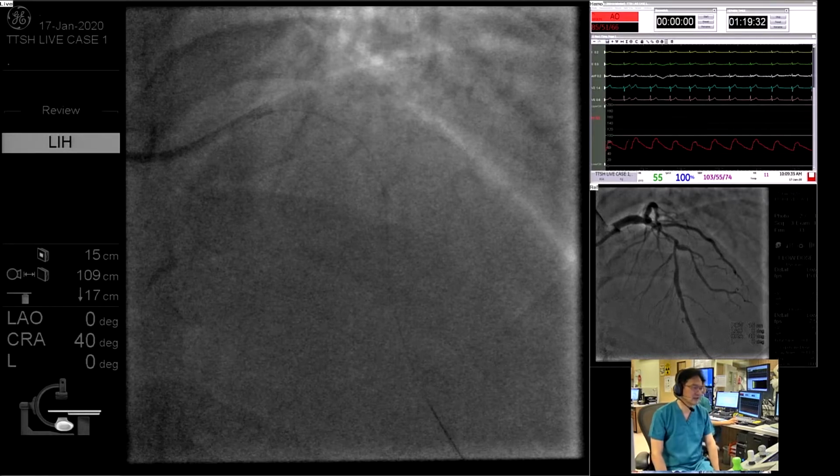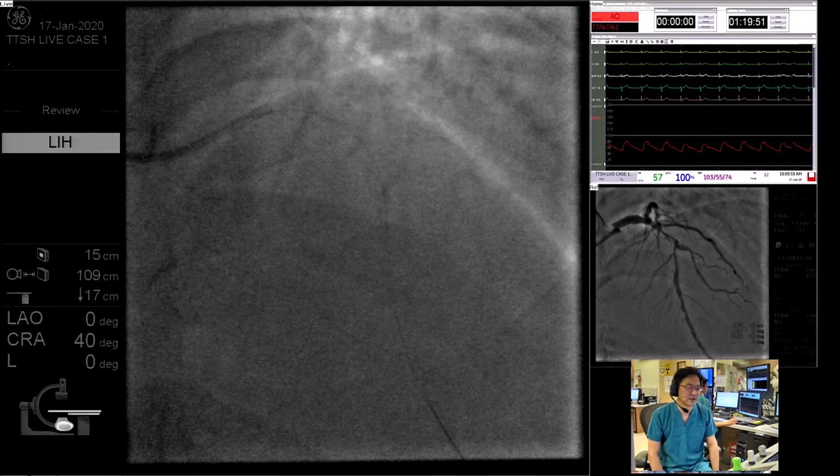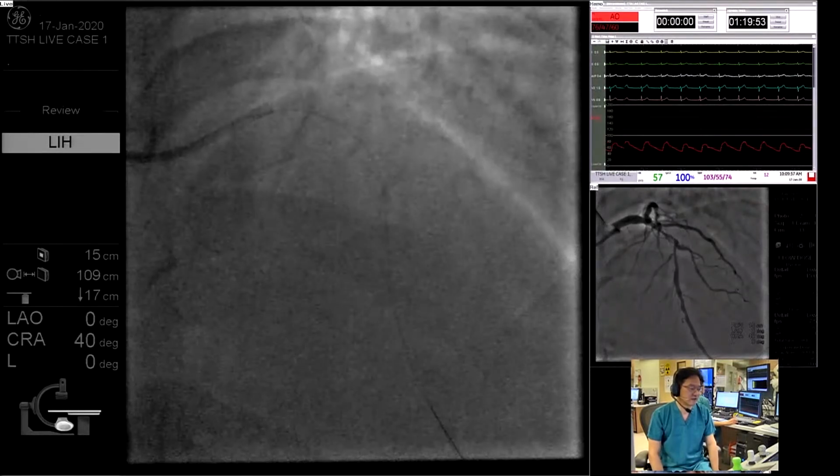I want to give you another example that I did recently using the system, with an OPN high-pressure balloon. 300 is good. Can we put the stent back in? In that case, after the OPN, and some of us will have experience of balloon wire fusion, that balloon was inflated at 35 bar, and I was expecting there would be balloon wire fusion.